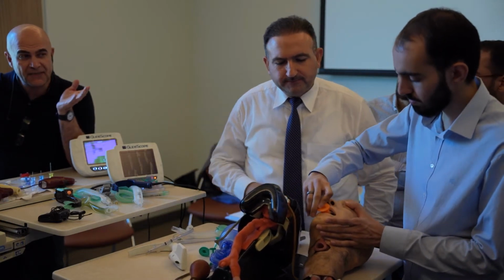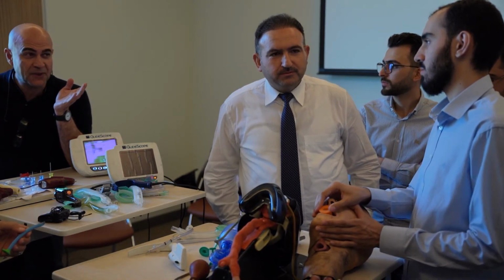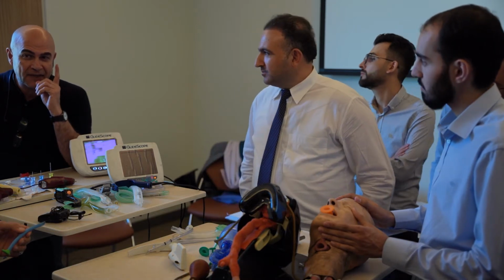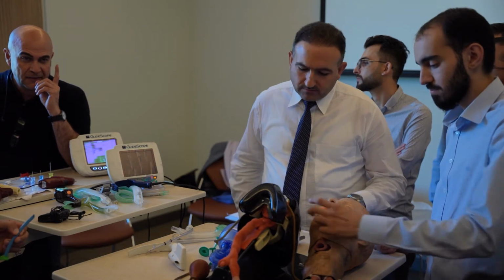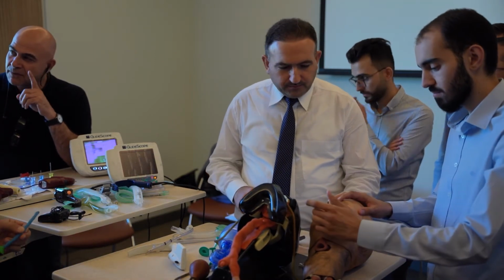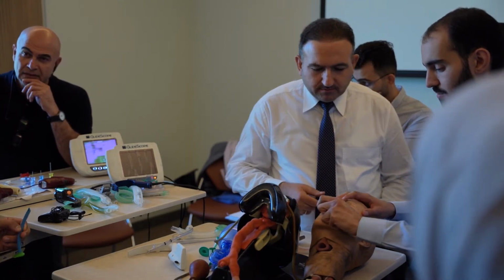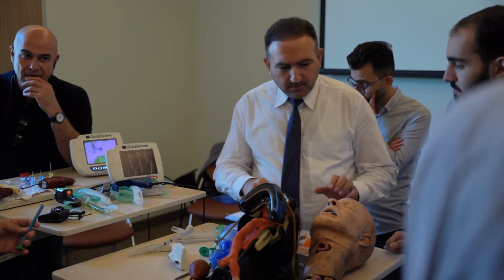Believe me, this is a life-saving measure. Don't underestimate the basic airway. It is more important than the definitive airway. The definitive airway carries a very high mortality, for your note. There is even a special algorithm called post-intubation cardiac arrest, and post-intubation hypotension. A very hazardous procedure.